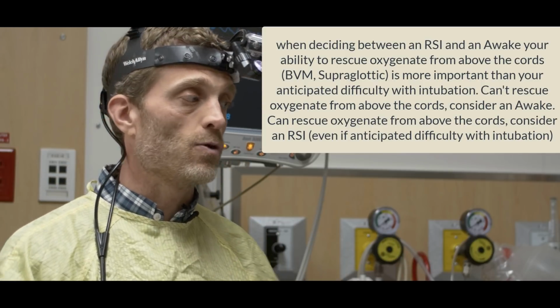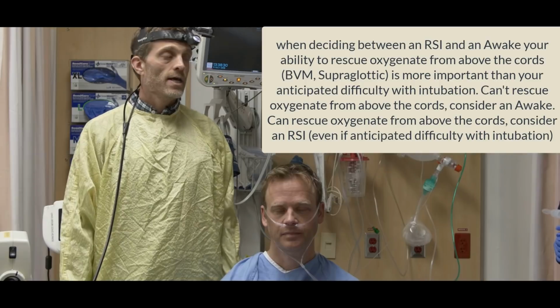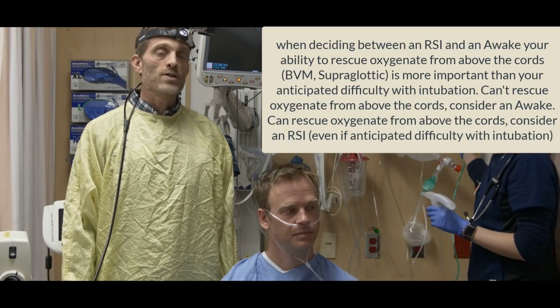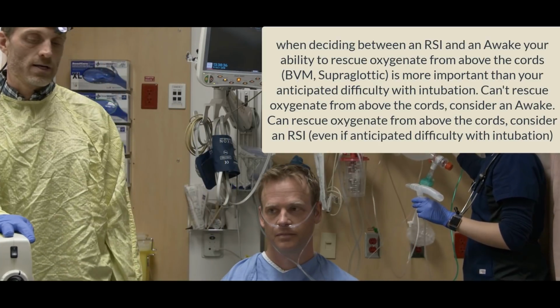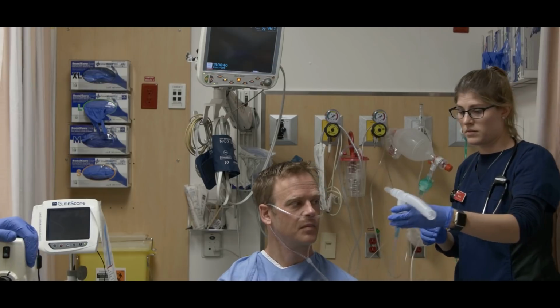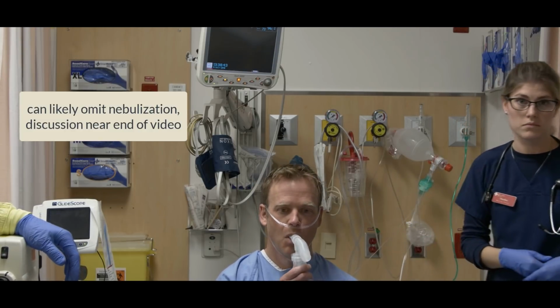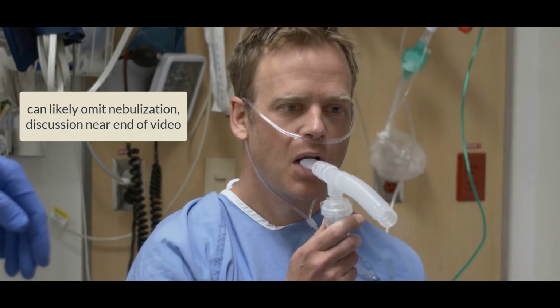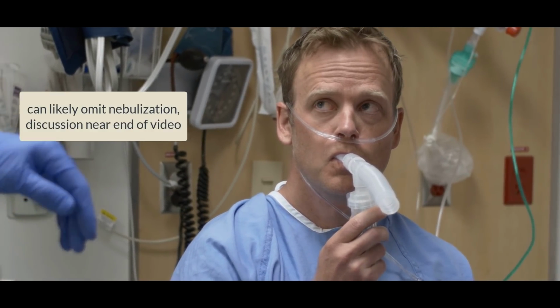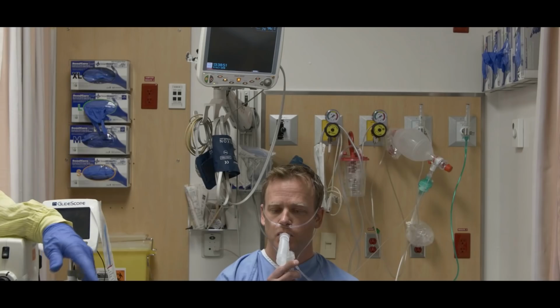So the biggest thing with an awake intubation is topicalization, and so we're going to have Marika here, 1 cc of 4% xylo, and we're going to start with a nebulization first. Good, thank you. Yeah, and Chad, when you inhale, just if you can, kind of a quick inhale. Actually, the faster your inspiration, the more of this that rains out in the upper airway.